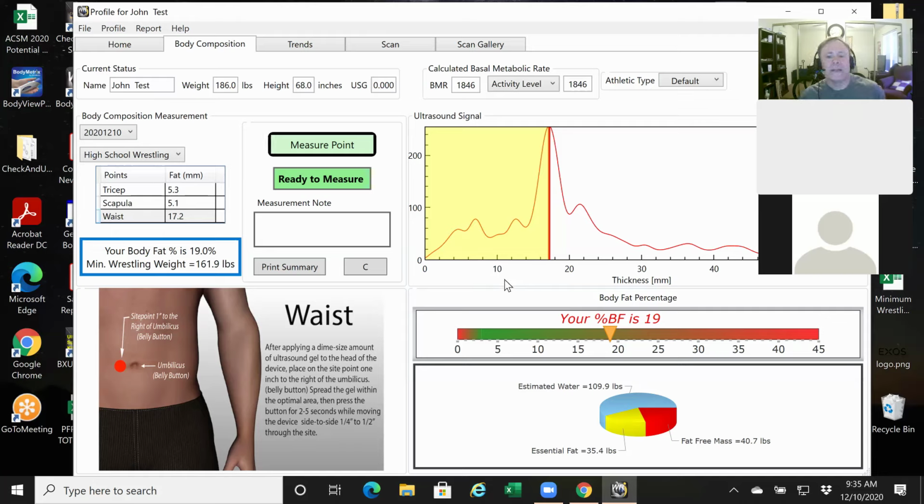So again, pretty easy to use. Now, I want to give you a couple of other tips and then give you an outlier situation that came up with an assessor recently. And it's really more when you're considering an athlete that has excessive abdominal adipose here. They've got a roll. Those kids are probably going to exceed 25 on the scale. I like to use 25 as a good mental reference, and here's why.